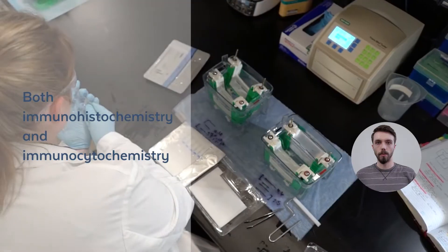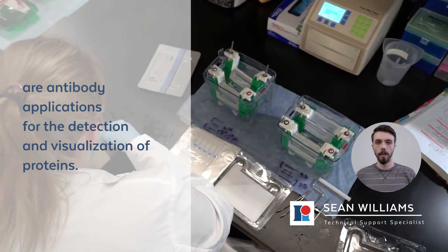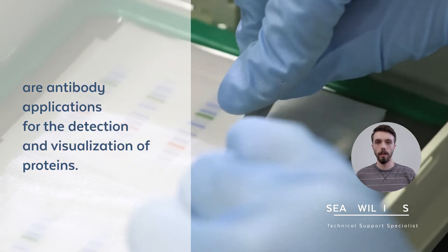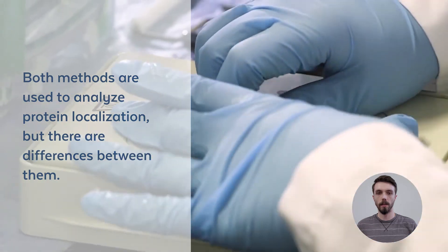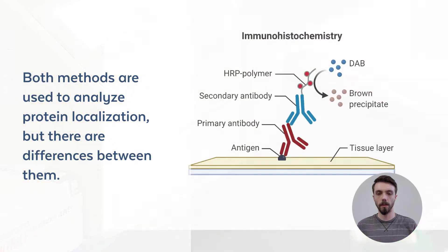Both immunohistochemistry and immunocytochemistry are antibody applications for the detection and visualization of proteins. Both methods are used to analyze protein localization, but there are differences between them.